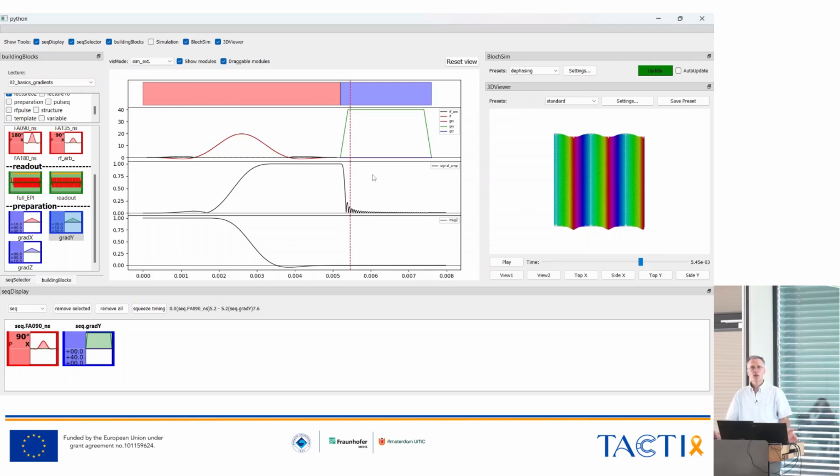And for imaging, we need to cover the whole K-space. So what EPI actually is doing is that it just acquires the whole K-space by zigzagging through K-space, switching gradients on and off.